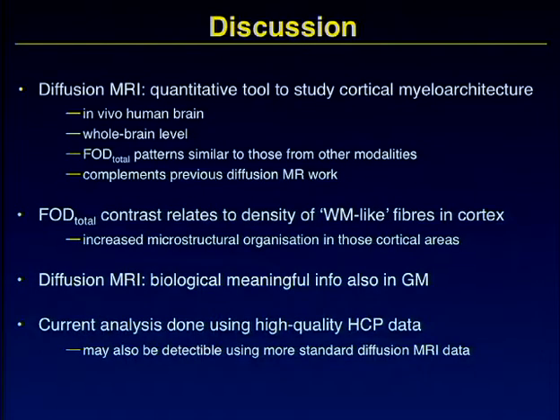So with the previous CSD, let's call it standard, I guess a lot of people have done tractography. And so how will this new method affect tractography? Yes, I guess it's affecting where the gray matter meets the white matter. If you're in the bulk of the fibers, then there is not much difference between the standard CSD and the multi-tissue CSD.